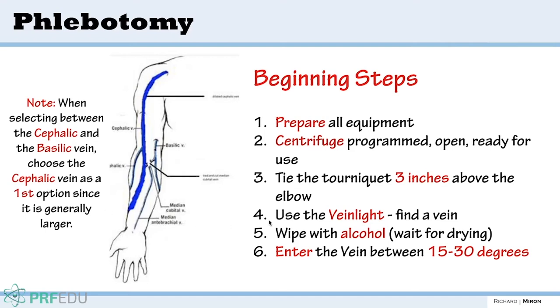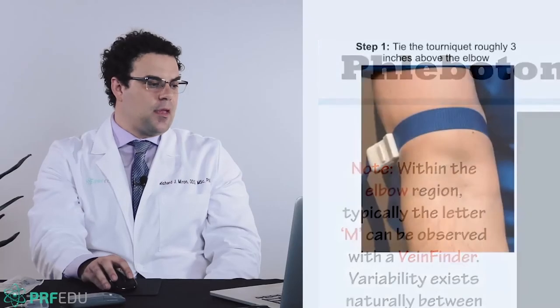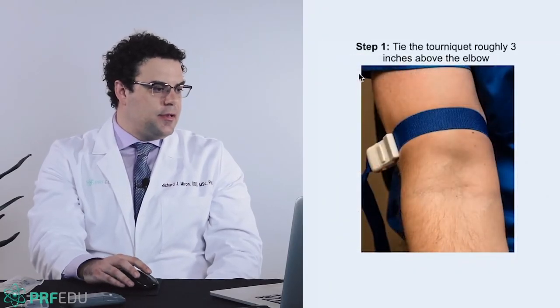Tie the tourniquet 3 inches above the elbow. Use the vein light. When you find the vein, wipe with alcohol. Make sure you dry. Enter the vein 15 to 30 degrees, okay? At the very end, you're always going to remove the tourniquet, patient relax the hand, remove the needle, and press the puncture area. So here's the steps.